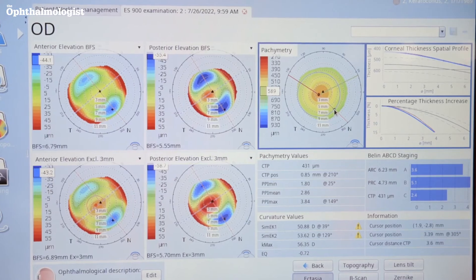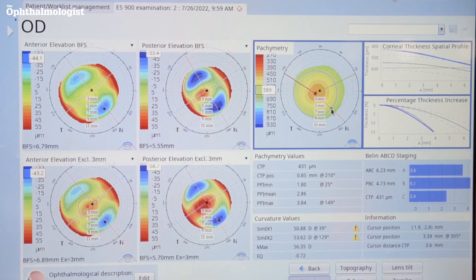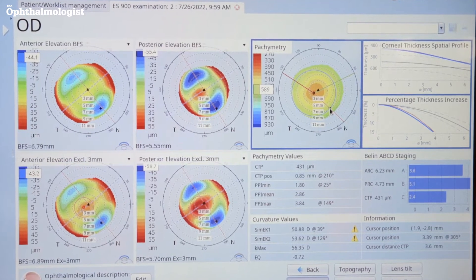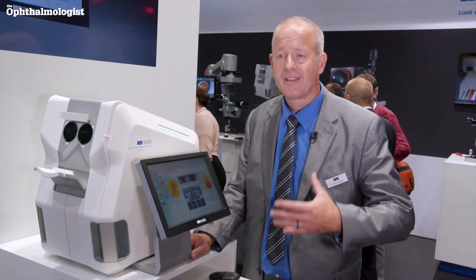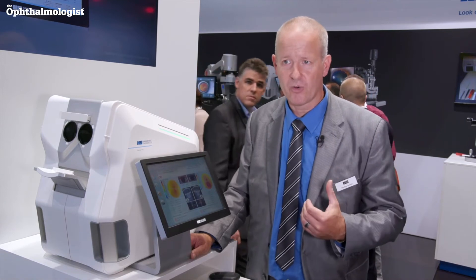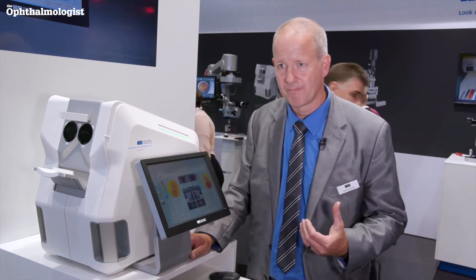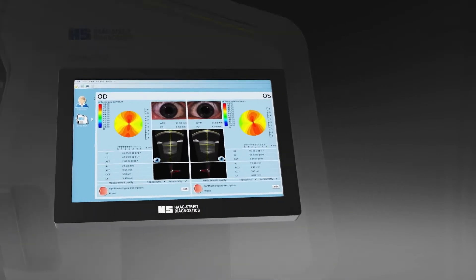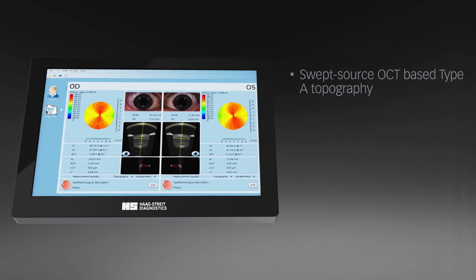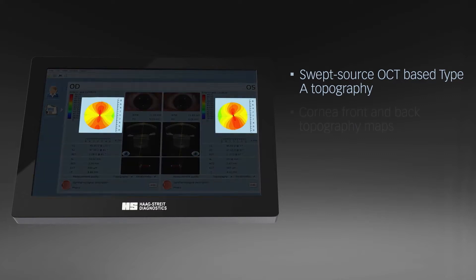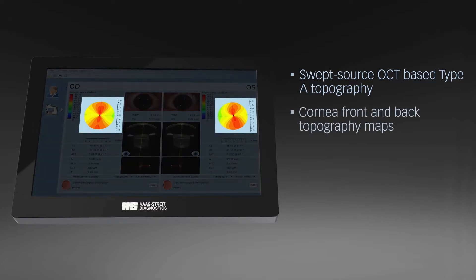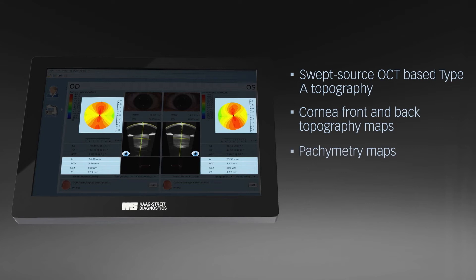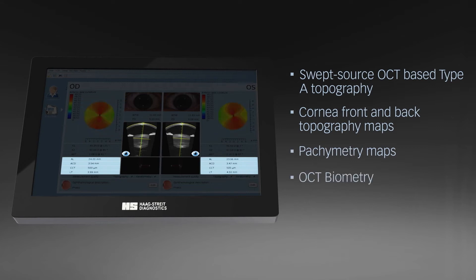Cataract and refractive surgeons both depend on highly accurate measurements. The iStar provides swept-source OCT-based biometry from the cornea to the retina — every single compartment of the eye is measured laser-optically. We also have OCT-based topography, which is in accordance with class A topographers.